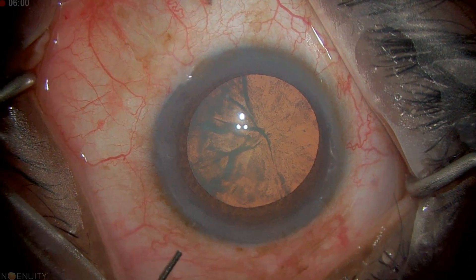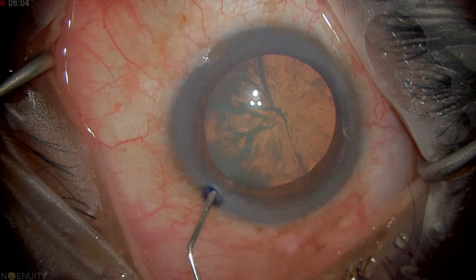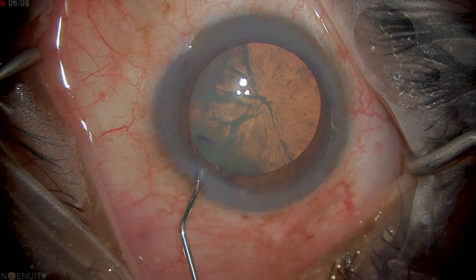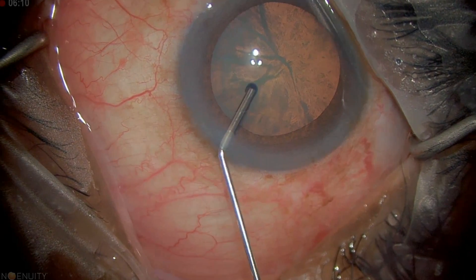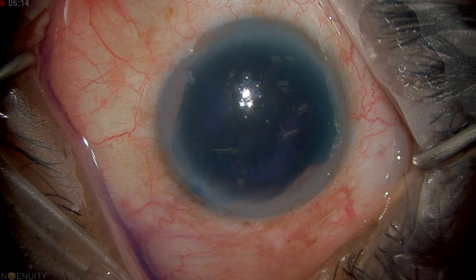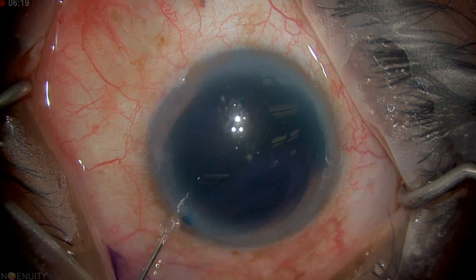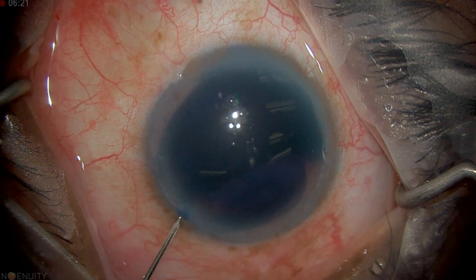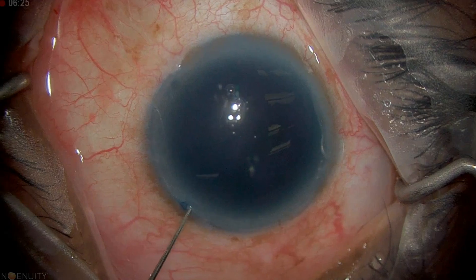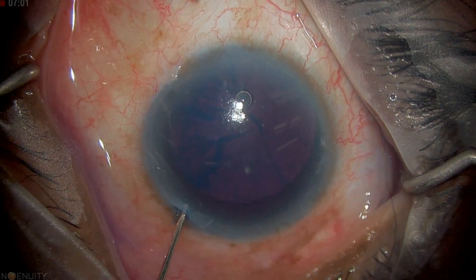Now we're going to put in some Vision Blue, going through our stab incision and injecting Vision Blue. We used to inject an air bubble because of endothelial toxicity, but we found that with the small amount of Trypan Blue we're putting in and the quick irrigation, the endothelium tolerates it just fine. We put in a little bit of Vision Blue and now we're going to irrigate it out.